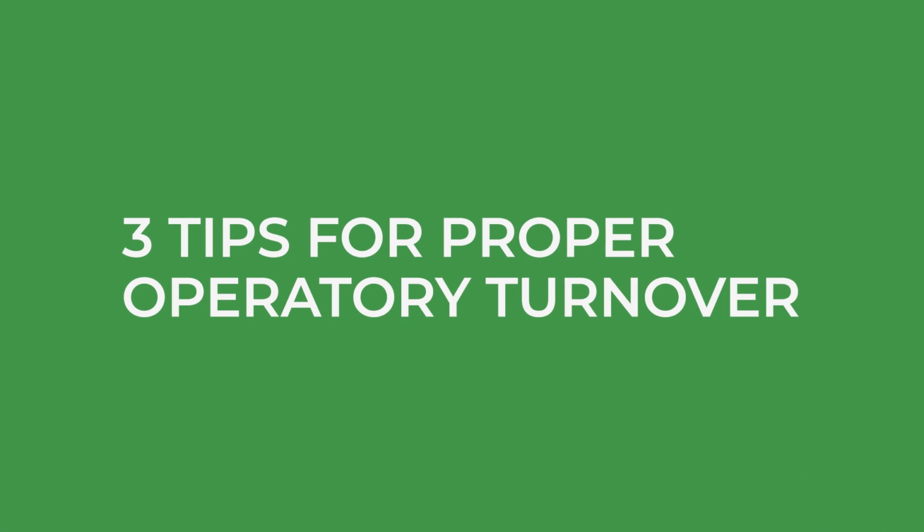After each patient interaction in the treatment room, we hustle and quickly gather our instruments for reprocessing and turn over our room for the next patient interaction. We do it so many times in a day that it's important to stop and consider whether it's being done properly. Here are 3 tips that can help make your operatory turnover safer and faster.